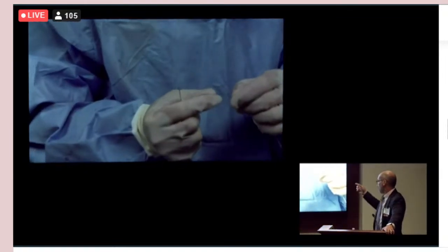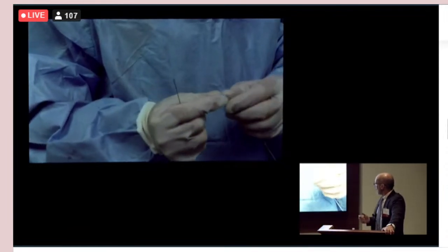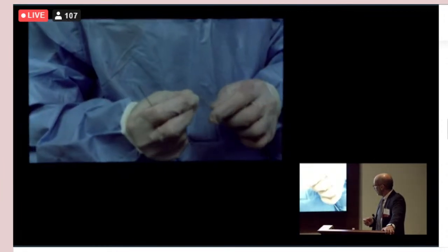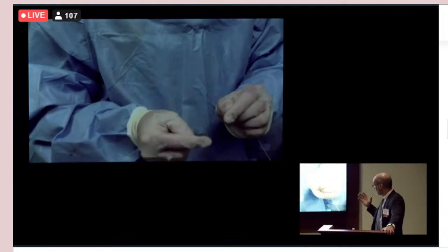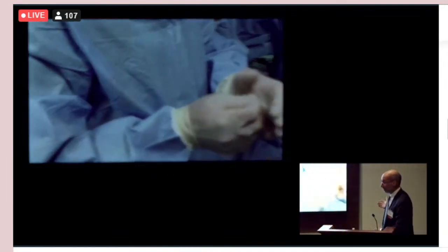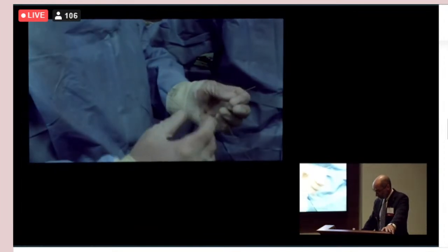So we've chosen for this a 2 millimeter by 6 millimeter balloon. We advance an angioplasty wire and we shape it in order to have some torqueability. This is, again, nothing particularly unusual in the angioplasty world. Give it some shape. And then we like to insert the balloon with a preloaded wire. This is important because if you put the wire first, then you need to have an extension length wire, which is 3 meters, and it's quite a pain to handle on the table. But if you have it preloaded, you advance both at once.